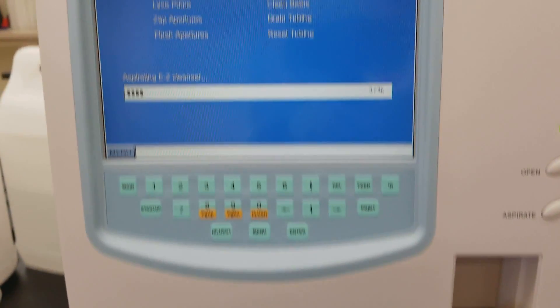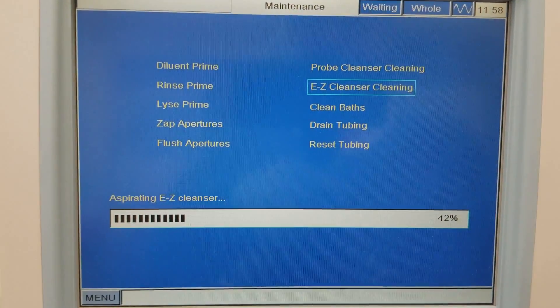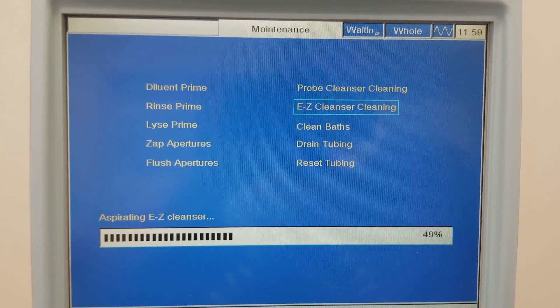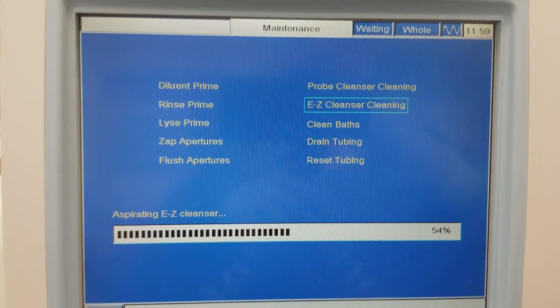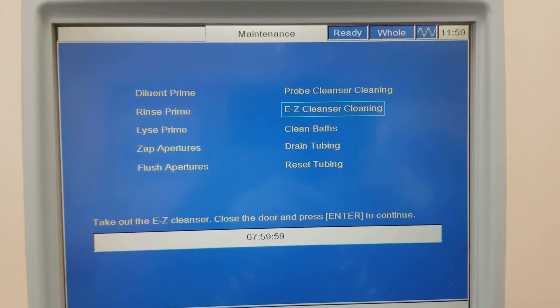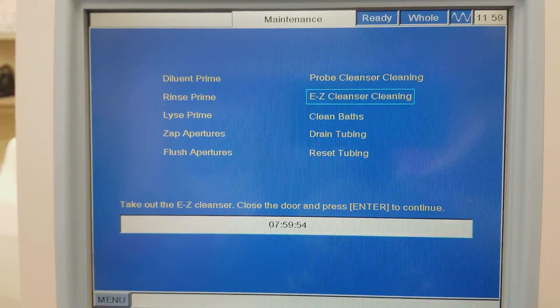It says it's at 44%, and it's going to show another screen and then the eight hours will start. That ended and the clock for eight hours has already started.